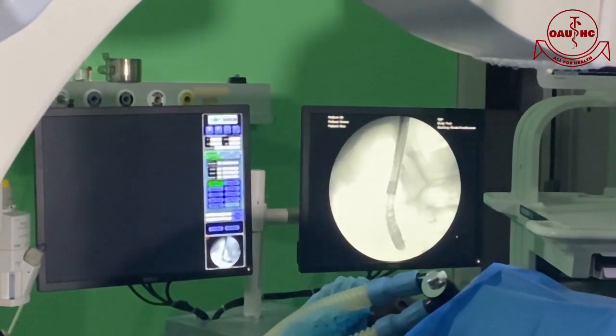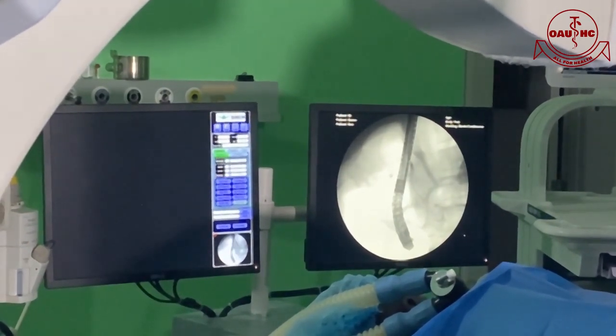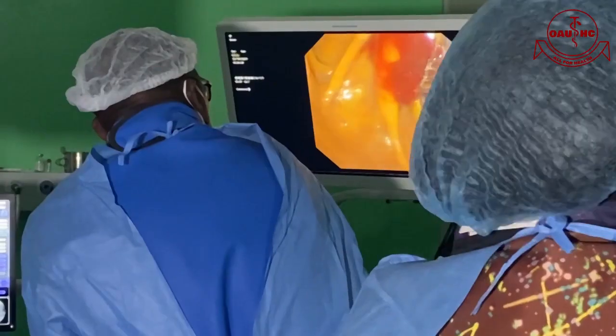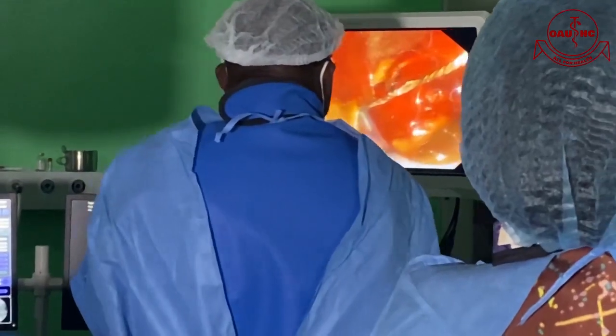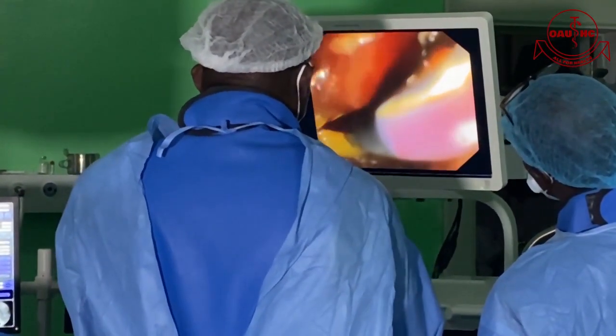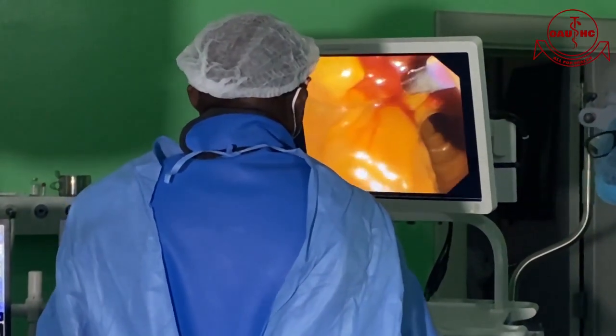We inject contrast into the biliary tree to be able to highlight it and identify where the problem is. And when we see the problem, we'll decide what to do: either put a stent in there, or remove the stone that is obstructing it, or just open the place wider, which we call sphincterotomy. So immediately we face the ampulla and are able to enter into the bile duct, we start evaluating the condition, then we perform the necessary treatment as the patient may need.